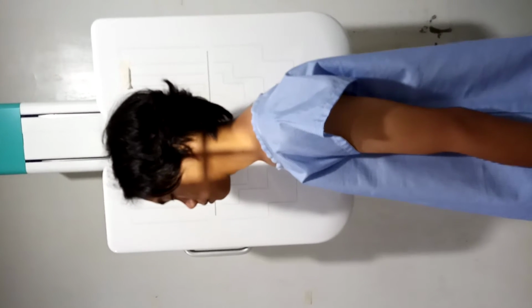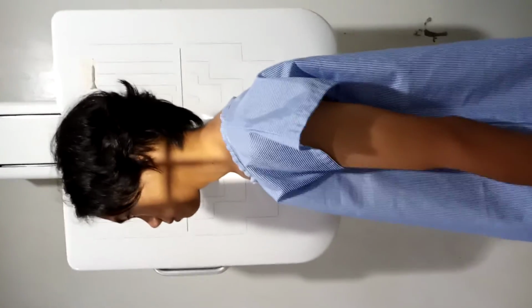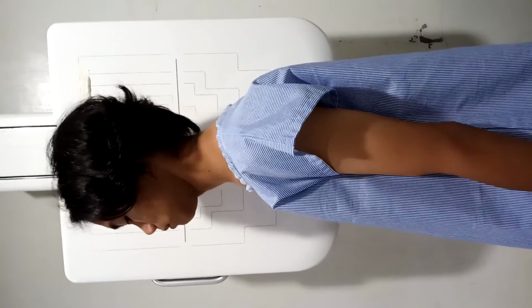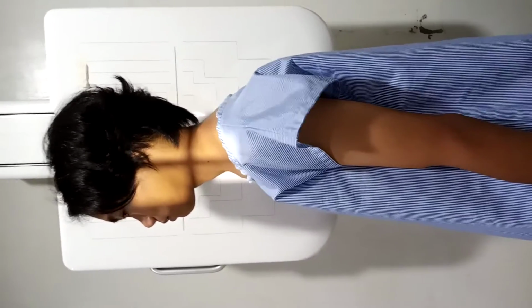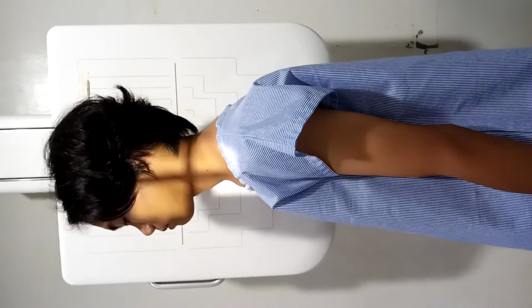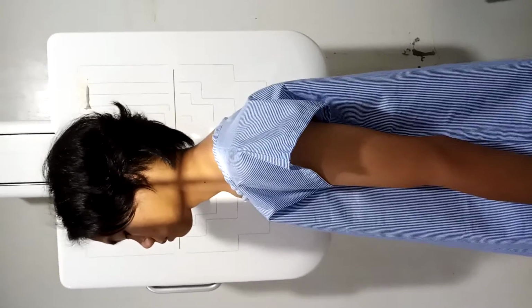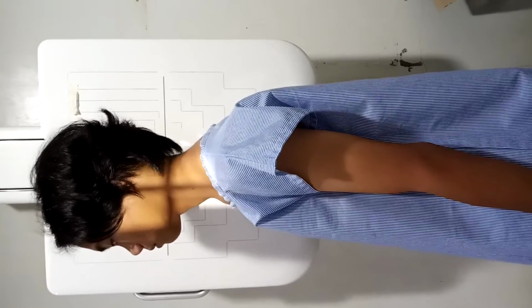In collimation, the mastoid tip. Okay. And that is our cervical vertebrae lateral, or Grandy method.